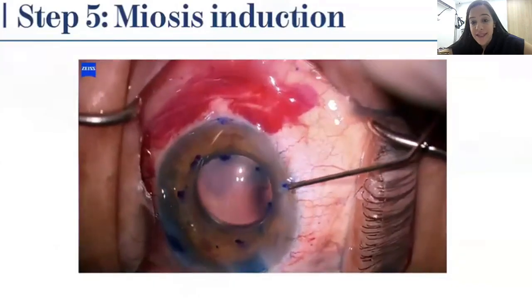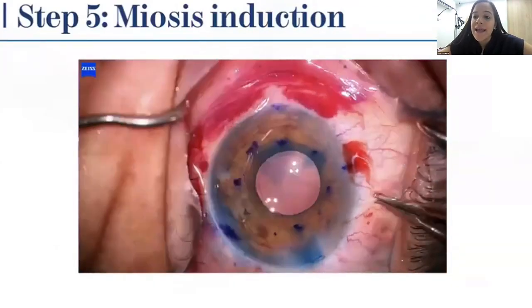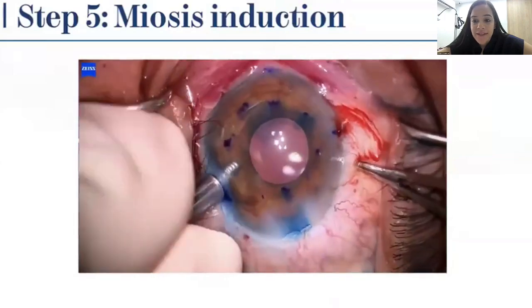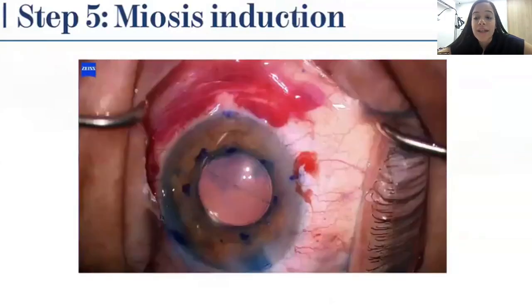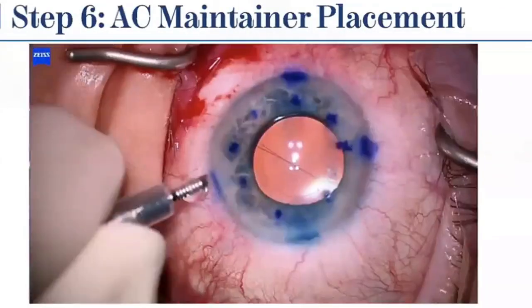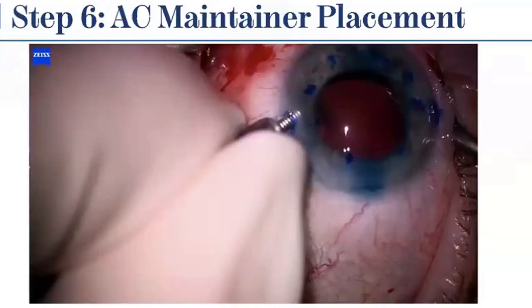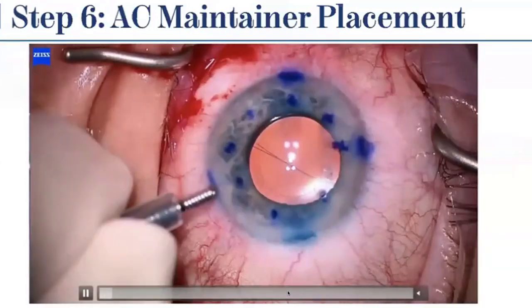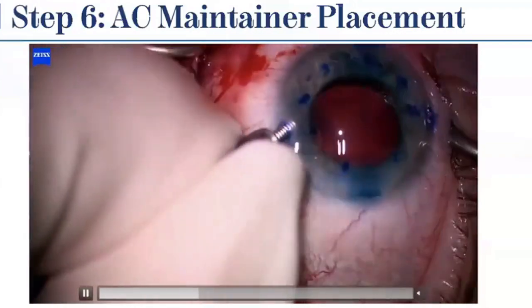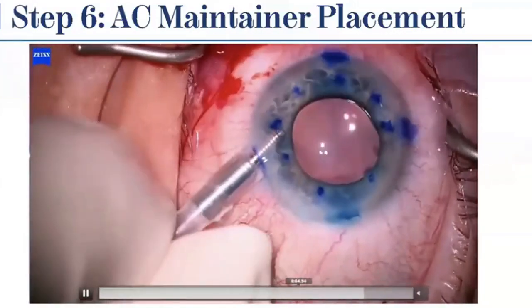Step 5, miosis induction. You can use Miochol or Miostat to prepare the eye for the insertion of the graft. This will reduce the risk of the graft slipping posteriorly during the insertion. Step 6. As I told you before, you are going to place the AC maintainer inferiorly, and it has to be bevel up, as you can see there, bevel up.